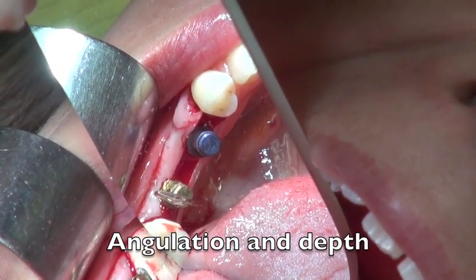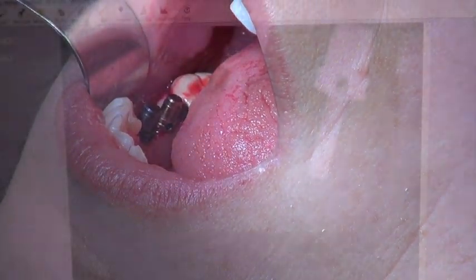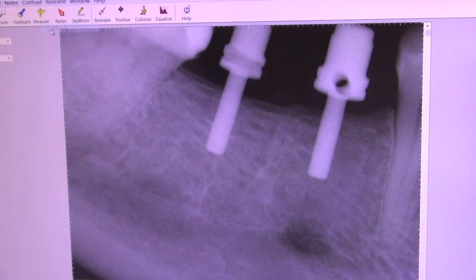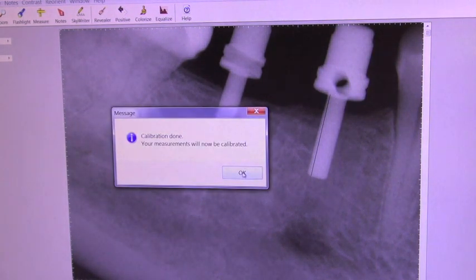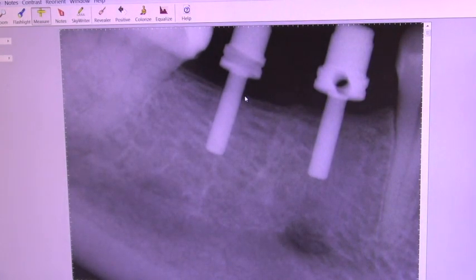To determine depth, I'll take an x-ray of the indicators using digital x-ray. I can calibrate the x-ray because I know the indicator is eight millimeters, so once I type this in, everything on the x-ray is calibrated to that eight millimeters. I can measure down to the nerve and confirm it's 13.2 millimeters on one side, and about 12.5 millimeters on the other side, so I have to be a little more careful in that position. We should still have plenty of space since we're not actually in the same 3D plane.